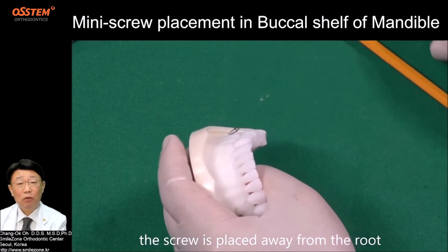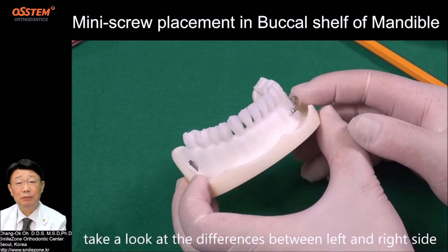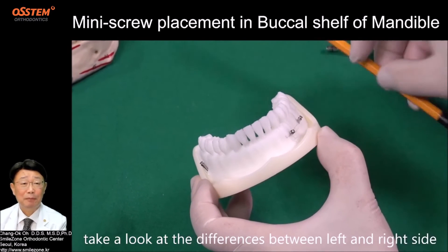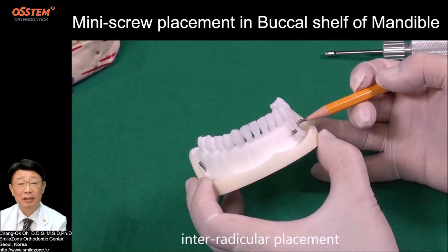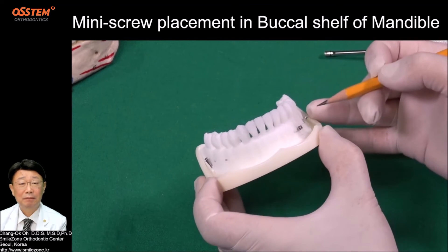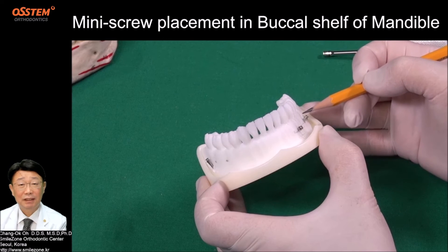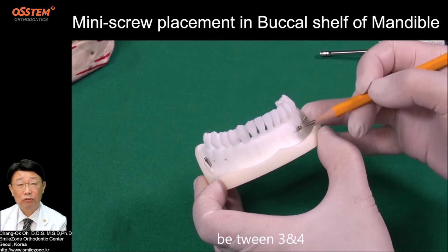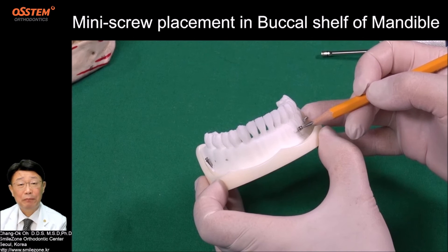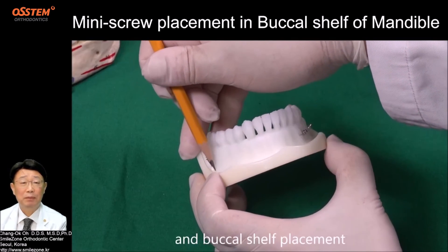The screws are placed away from the root. Take a look at the difference between the left and right side: inter-radicular placement between 5 and 6, between 3 and 4, and Buccal Shelf placement.